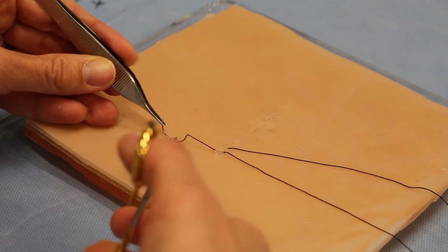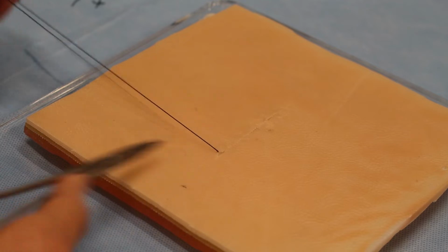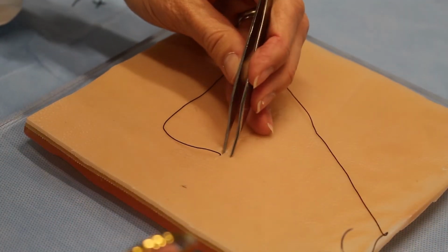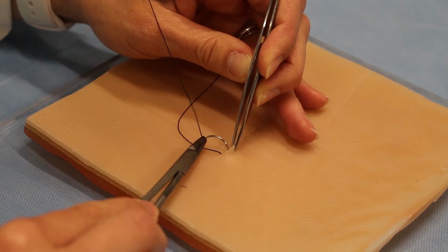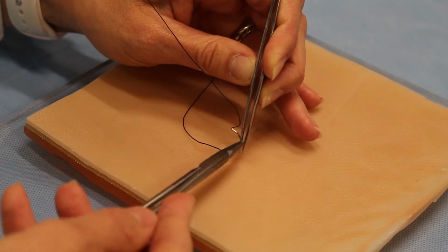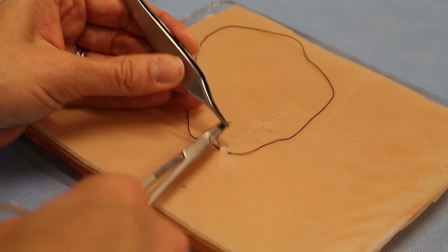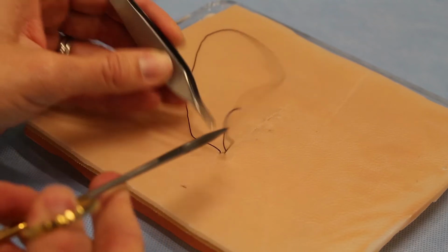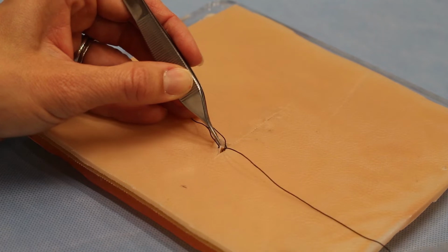Okay, so at this point you have this coming out superficial. Everything's superficial. We want our knot to be deep, so I'm going to come over here and pretend like we're doing the second half of that buried suture. You're going to come in just below the skin edge. You're going to come out deep in the wound. Now what I like to do here, and this may be a little different, but I'm going to show you the way I do it. There's a lot of ways to skin the cat.